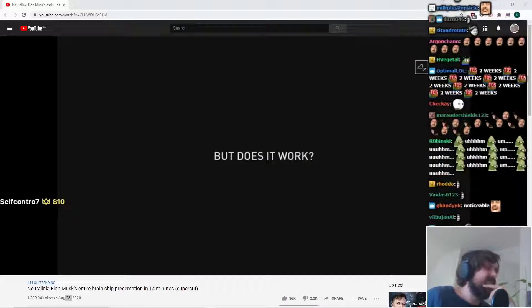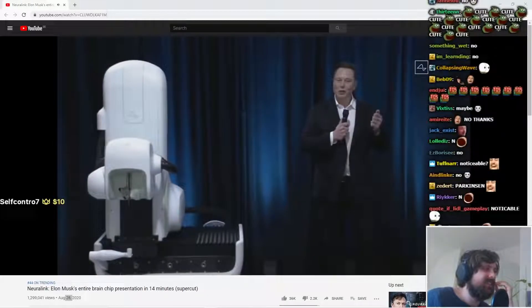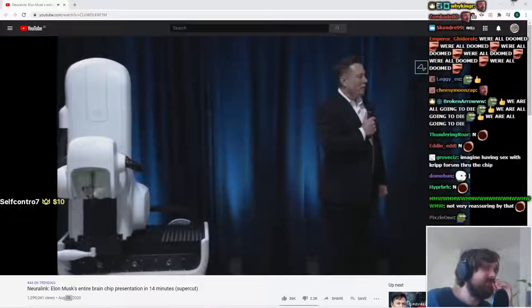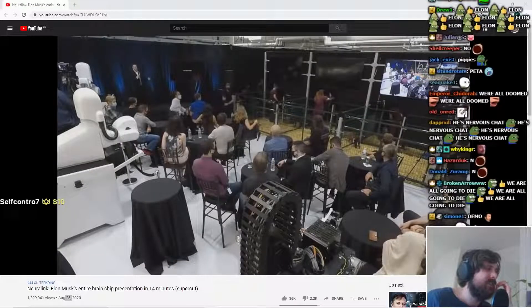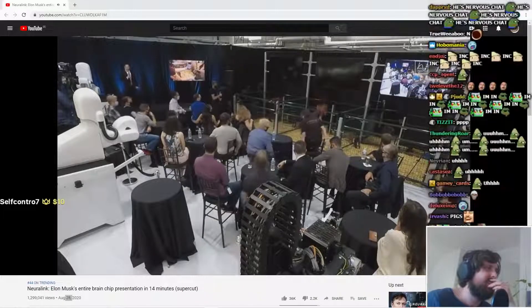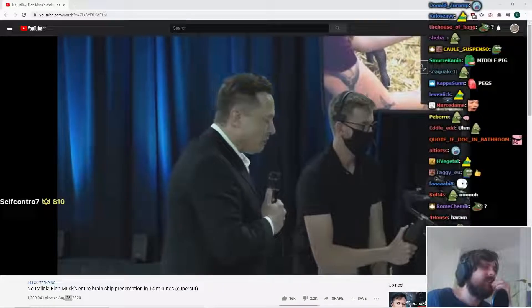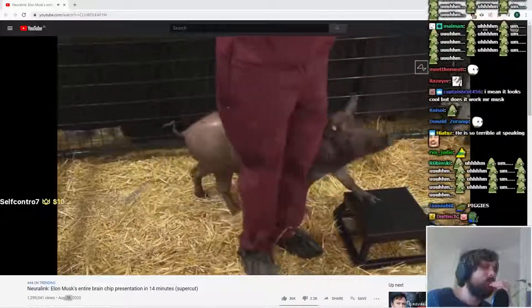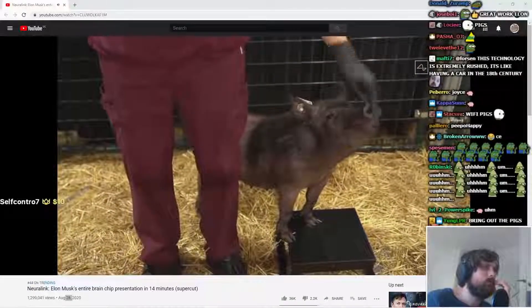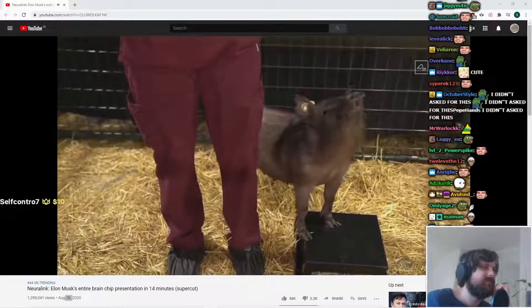So does it actually work? What I'm excited to show you — I'll call it the Three Little Pigs demo. We're bringing out the pigs. In pen number one is Joyce, and she does not have an implant. Obviously healthy and happy. We're trying to get her to go through it — and this is how you know she's alive.